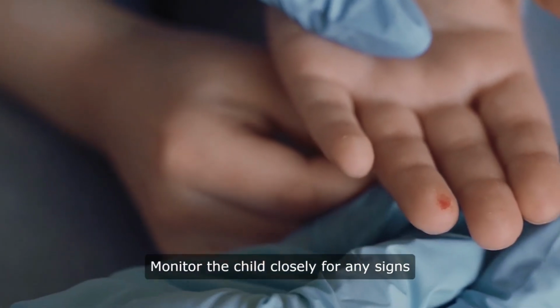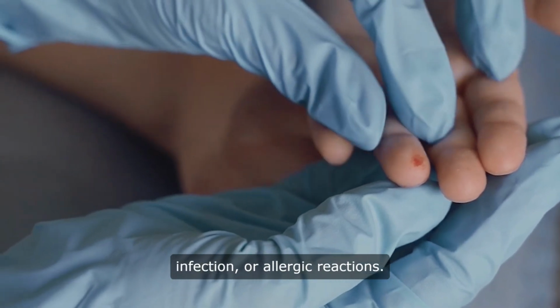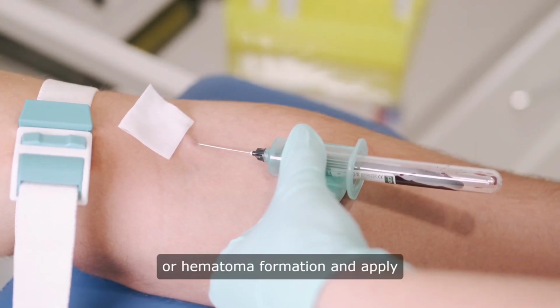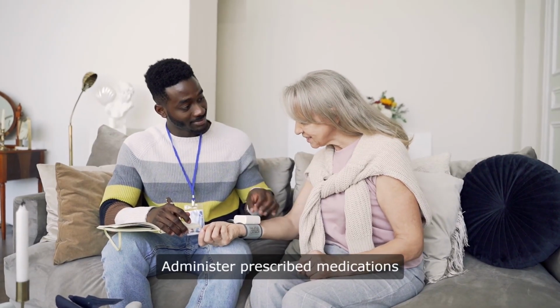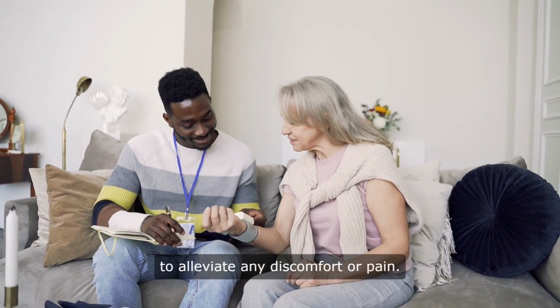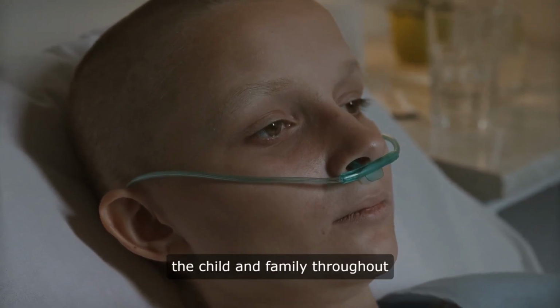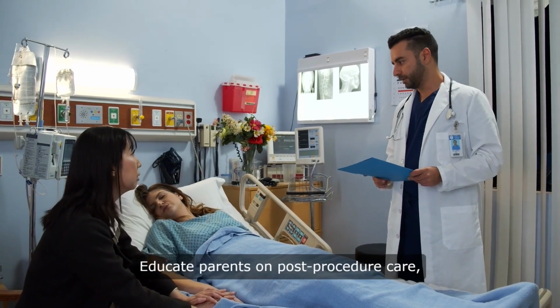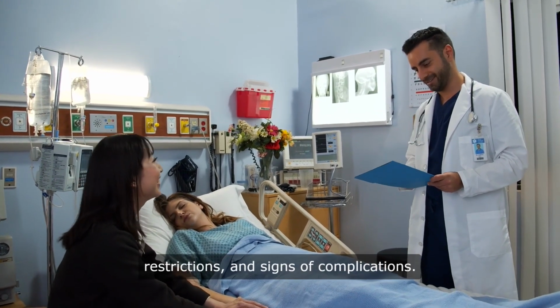Maintain a sterile field and ensure infection control practices are followed. Post-procedure, monitor the child closely for any signs of complications, such as bleeding, infection, or allergic reactions. Assess the insertion site for bleeding or hematoma formation and apply pressure or ice packs as needed. Administer prescribed medications and provide comfort measures to alleviate any discomfort or pain. Patient and family support. Provide emotional support to the child and family throughout the procedure and recovery period. Educate parents on post-procedure care, including medication administration, activity restrictions, and signs of complications.